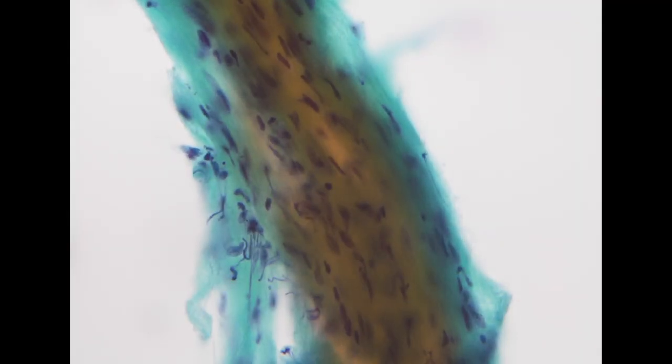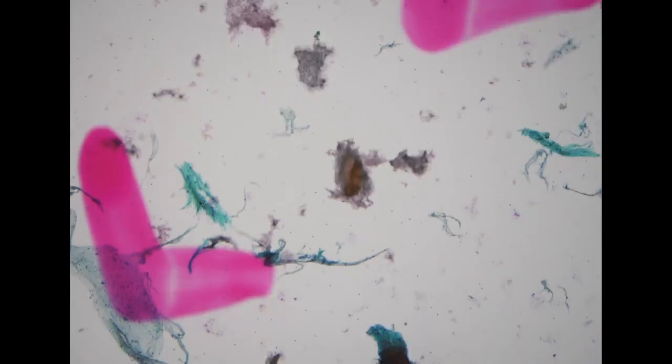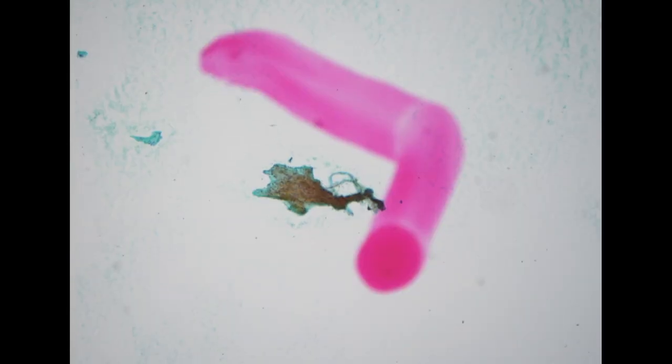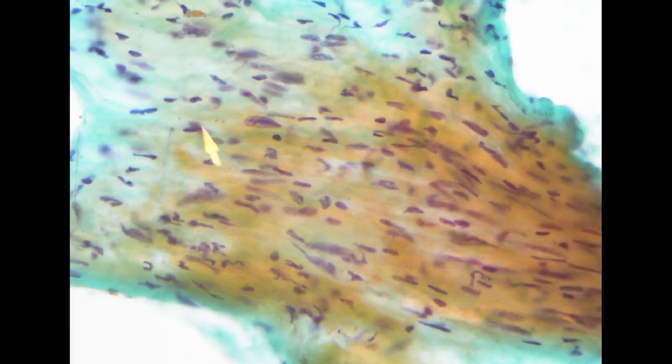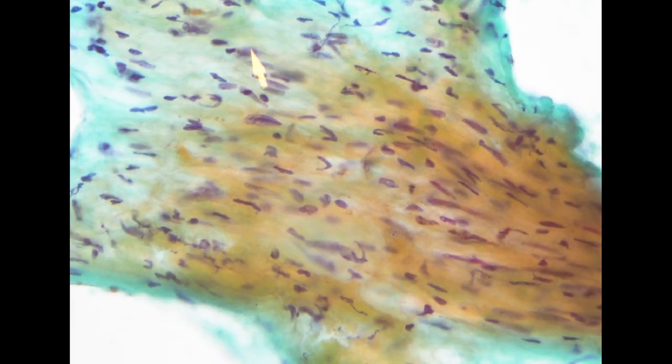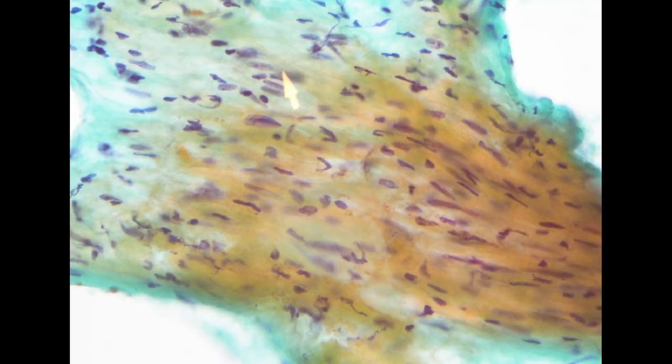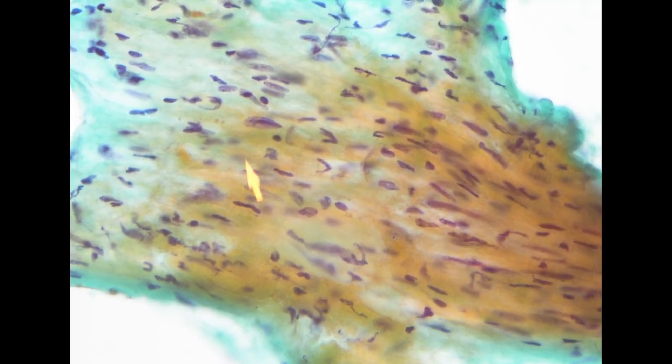which is also one of the most common soft tissue tumors that we will encounter in fine needle aspiration. So if we check the direct smear, it is much easier to see the nuclear feature. So again, we have these sausage shapes, some in a palisading pattern.